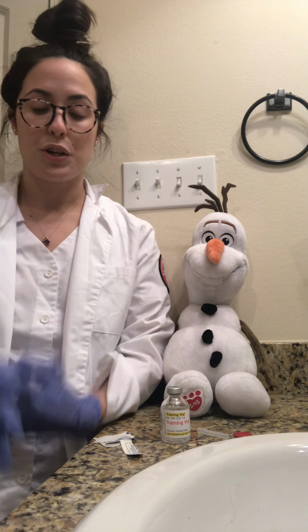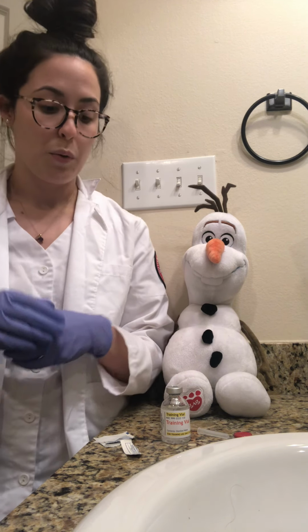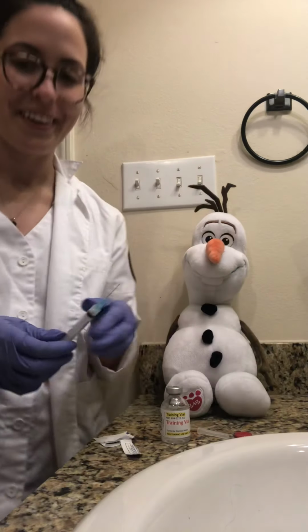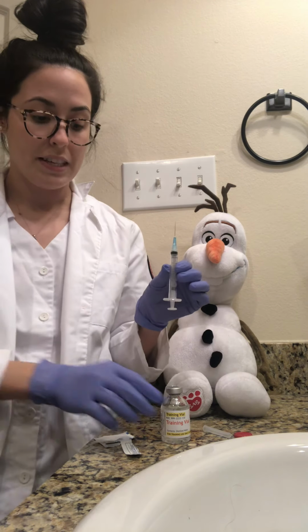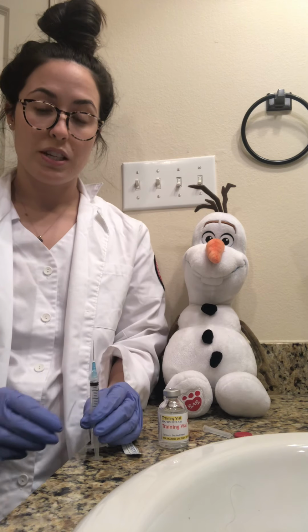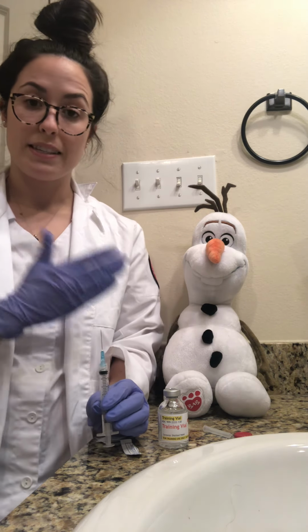You also want to make sure you have the right medicine, dosage, and route, which we are going to be giving. This medicine in this particular vial, and just to make sure the dosage is correct, we want to calculate it based off his weight.